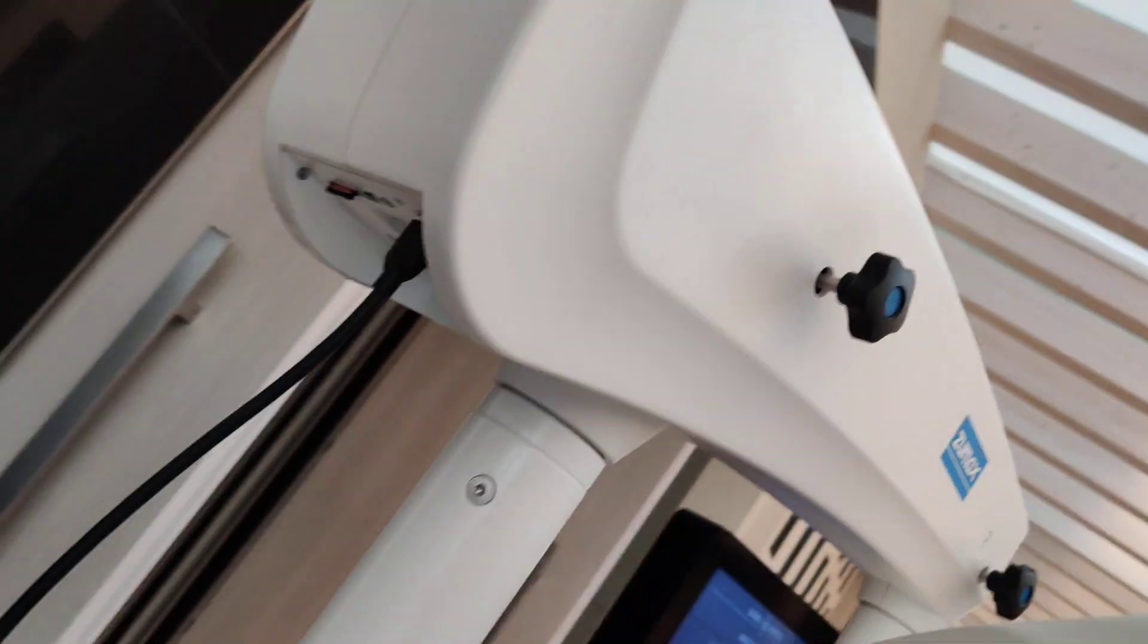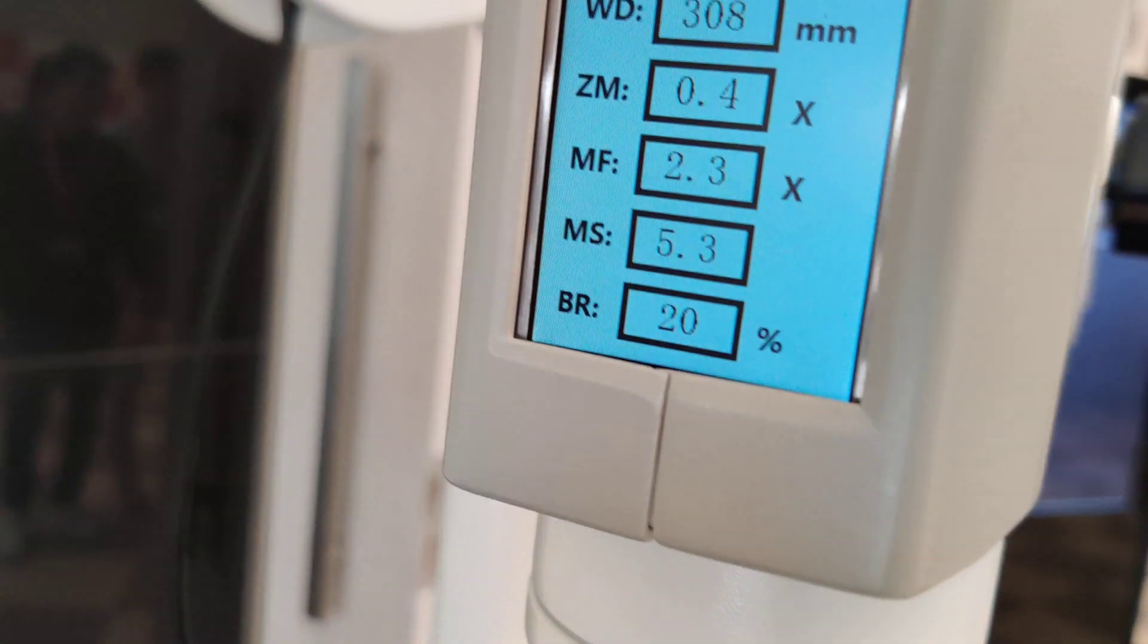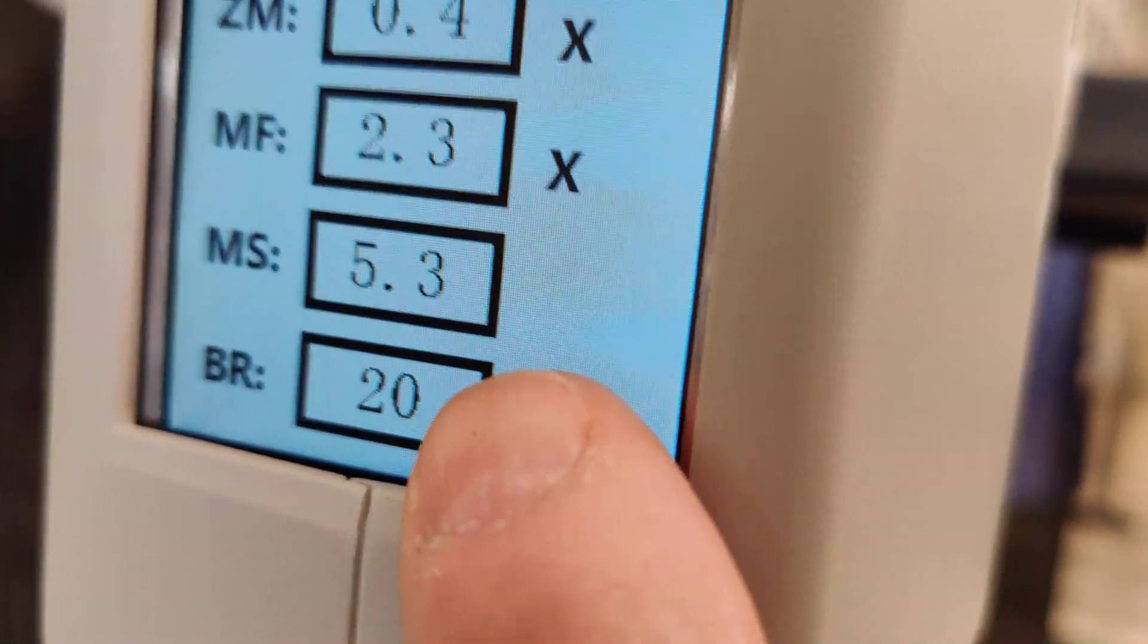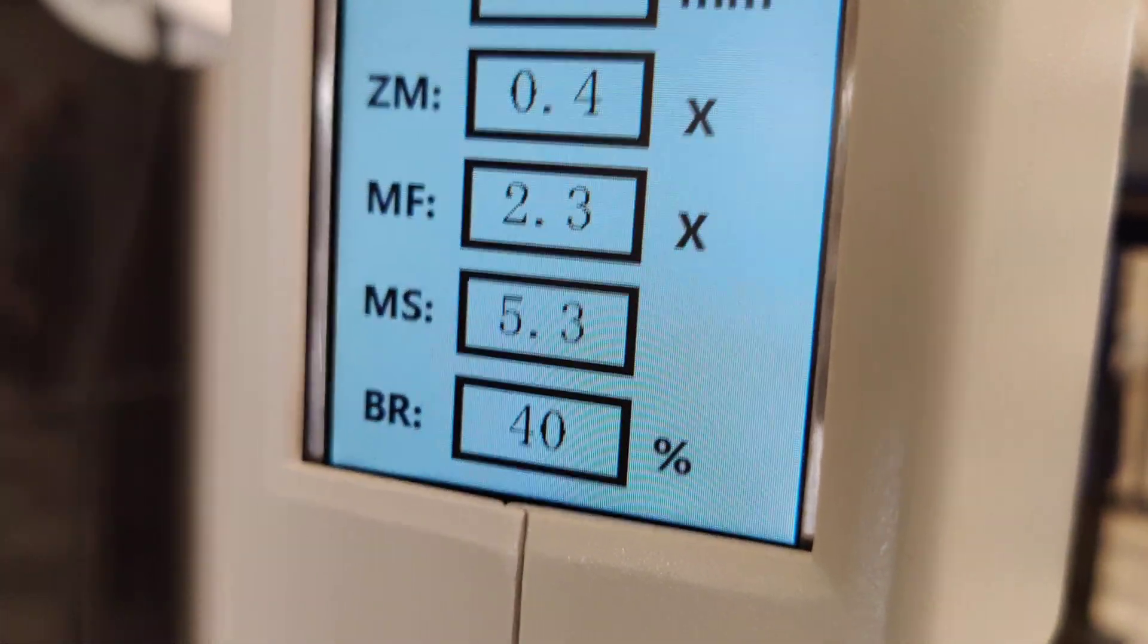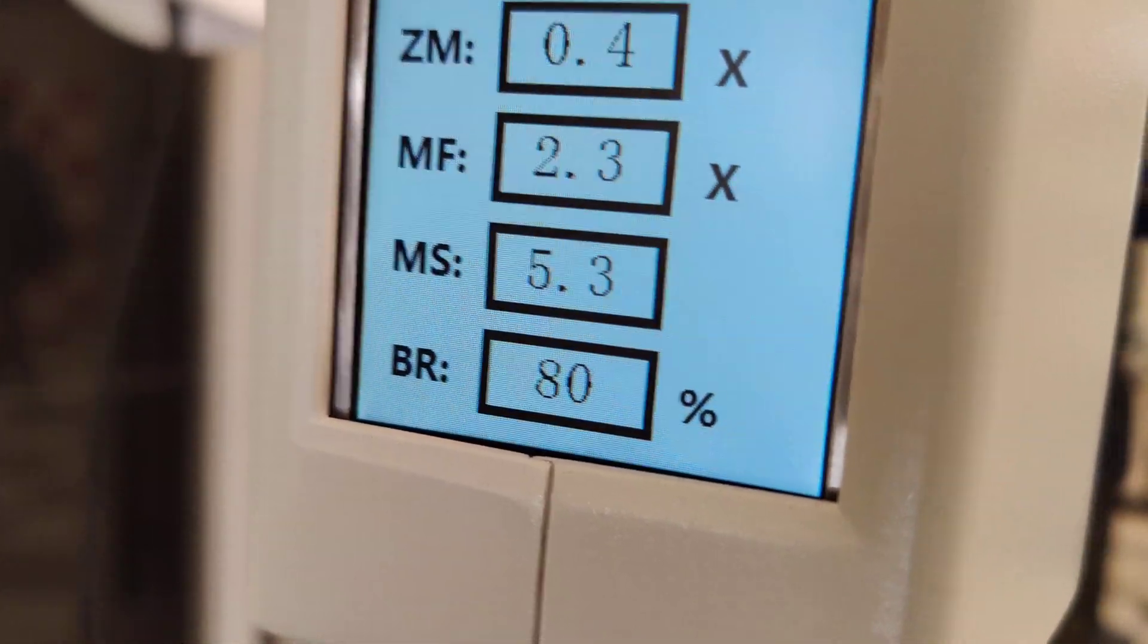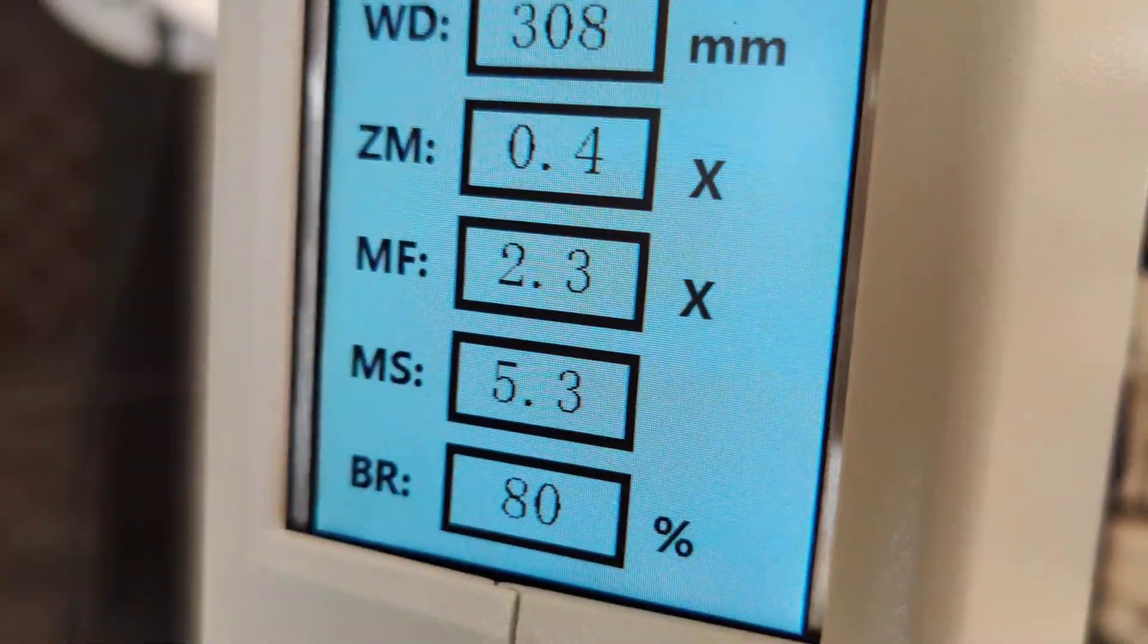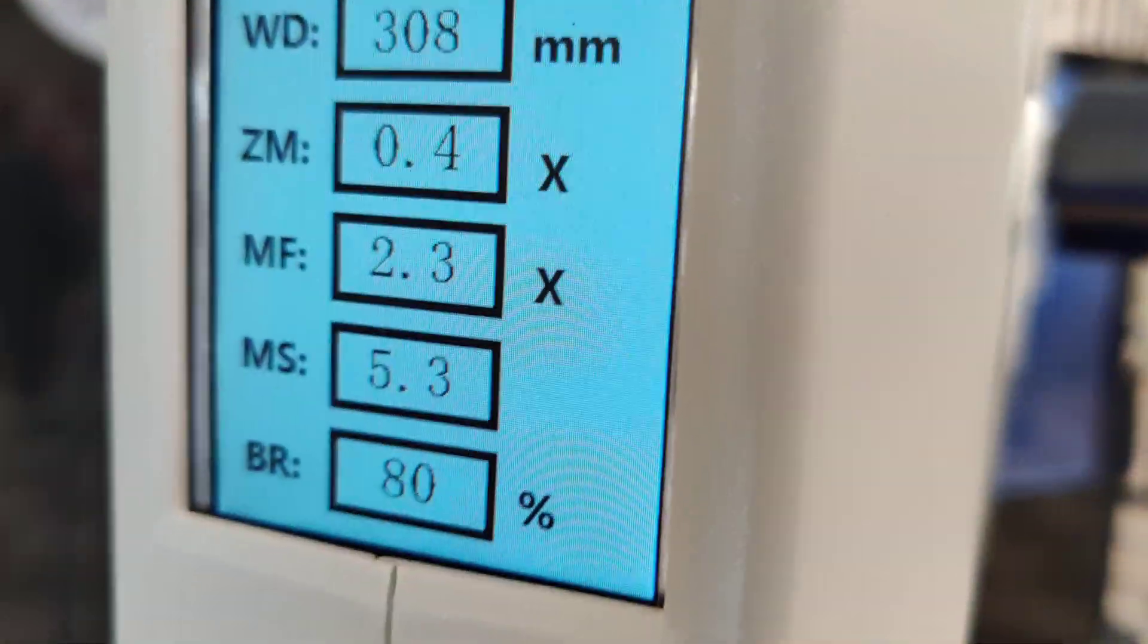The last thing that we are watching here is the brightness that we have here of the light. So if we increase the light, we increase the value of the brightness. Okay, the magnification, the zoom, and the working distance.